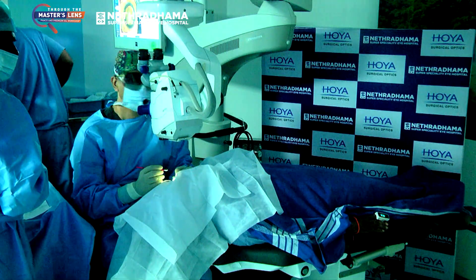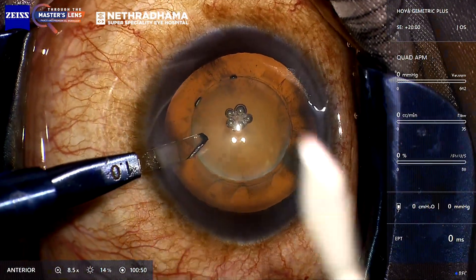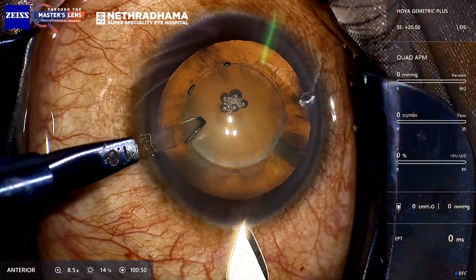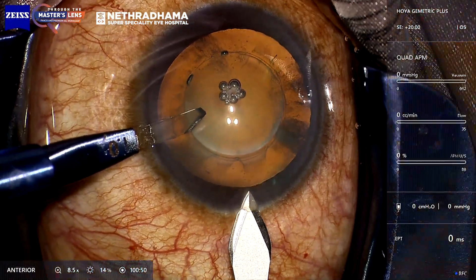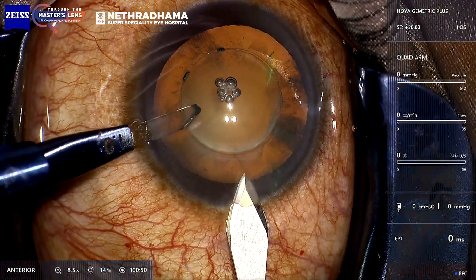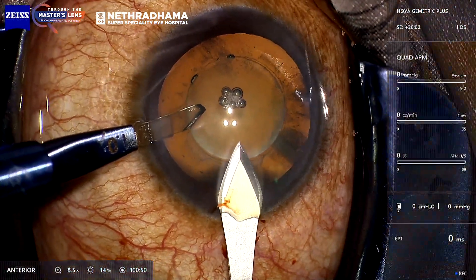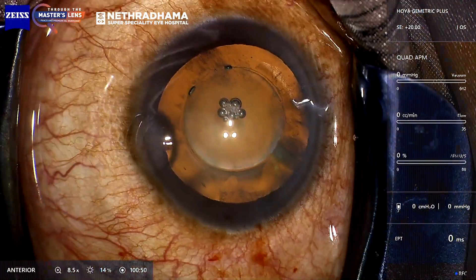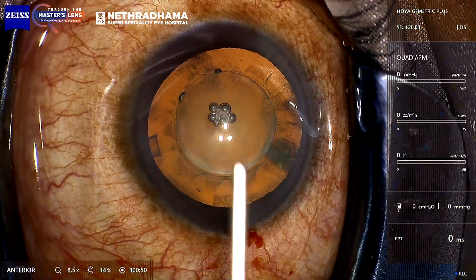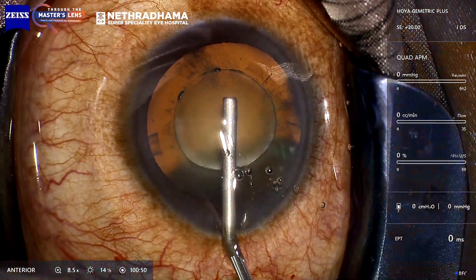I like to make the side port with a 1 mm diamond blade — I use this to stabilize the eye. This is a 2.3 or 2.4 mm keratome. It's triplanar: I go in, dip down, raise slightly, so that I don't get a chevron incision. You get a nice squarish incision. You can see the rhexis is already done.